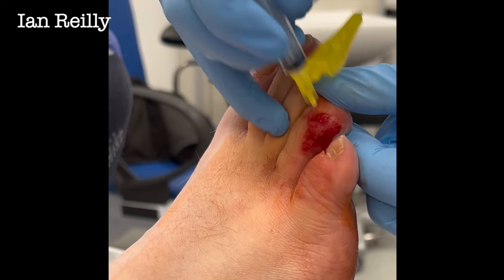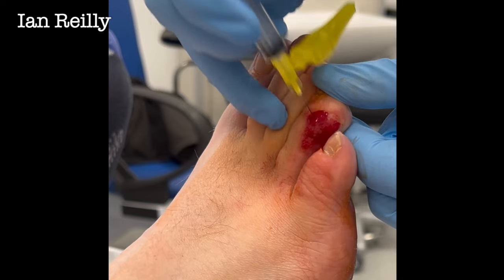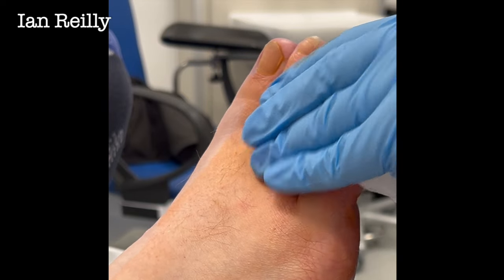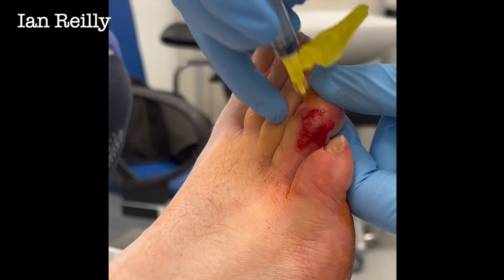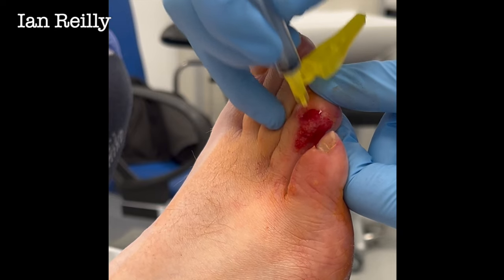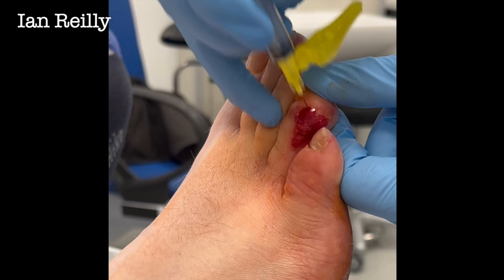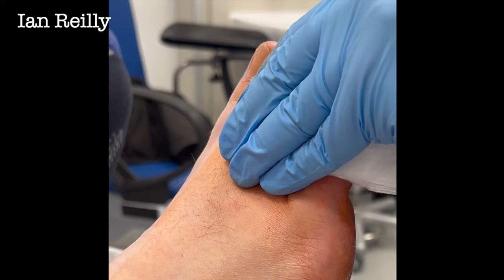With needling, we're just trying to pop some skin cells which are infected with the virus. The virus is in the skin and the body doesn't know it's there. So we're trying to release a few virus cells — I always think of the lottery, when they release the balls. It's kind of like that. I'm going to get a little five-second clip of Camelot: 'release the balls.'